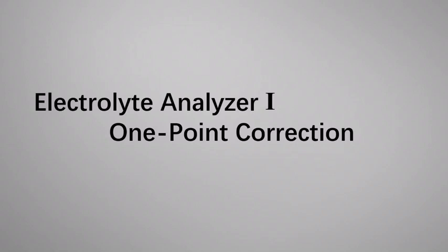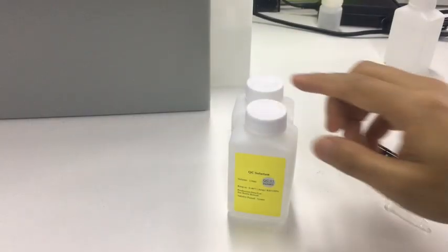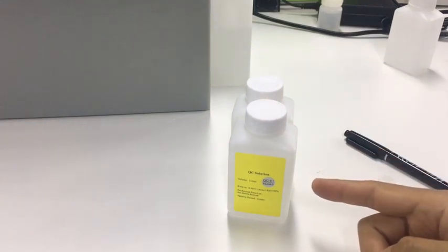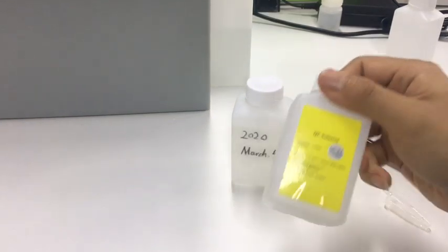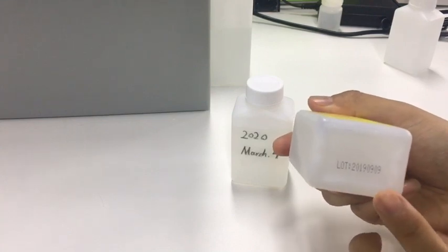This video will show how to make one-point correction. This is a reagent solution and QC solution used with the machine. We can check the lot number at the bottom of the bottle.